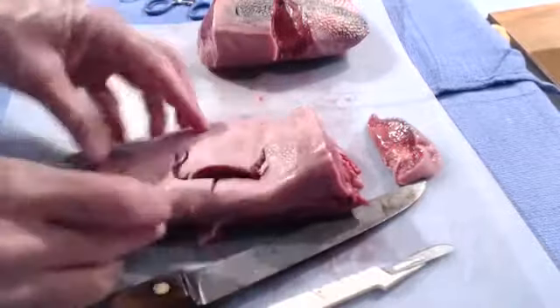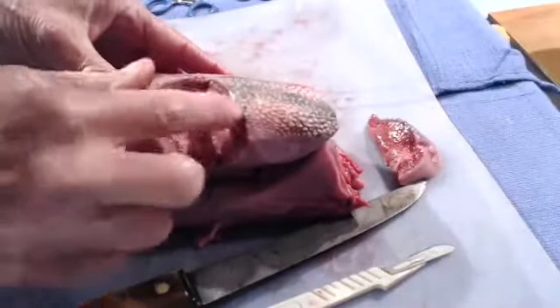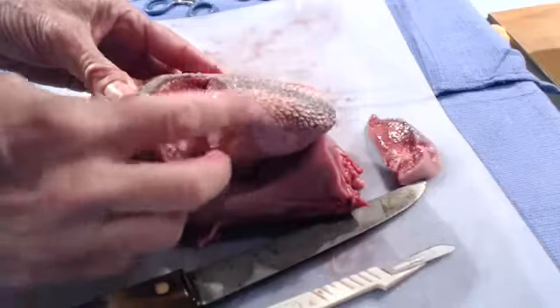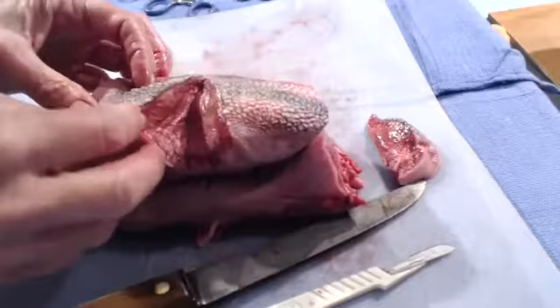Okay, and that's basically how you make the model. The benefit of the beef tongue, of course, is it has skin here. So you can do the subcuticular closure. You can close the vagina. Whereas with a plain old beef roast, you don't have that.